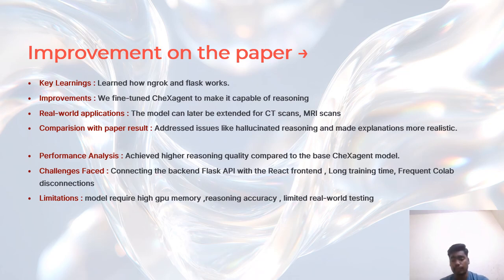And the challenges we faced were connecting the Flask backend API with the React frontend, long training times, and frequent Colab disconnections during fine-tuning. Coming to limitations, the model requires high GPU memory, reasoning accuracy can still be improved, and it needs more real-world testing for better reliability.